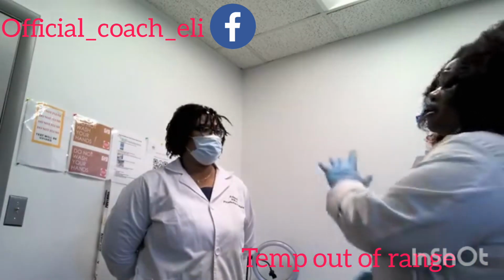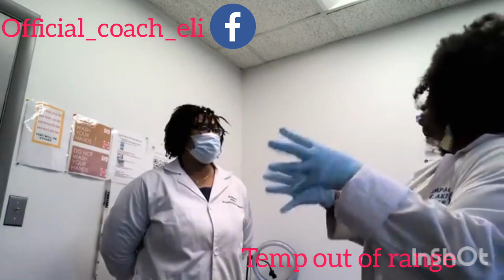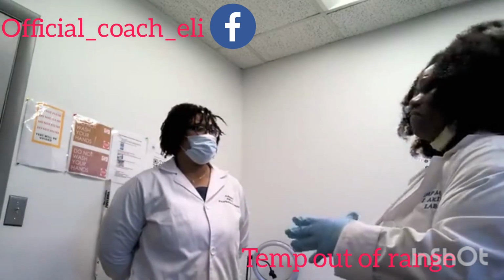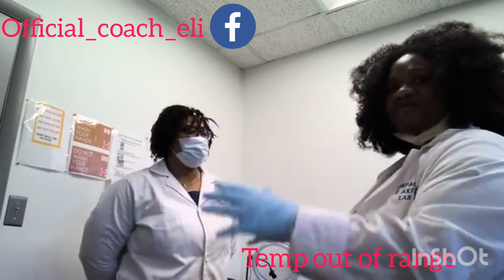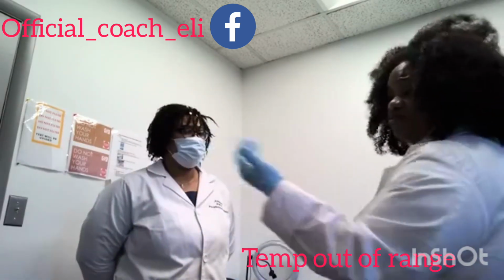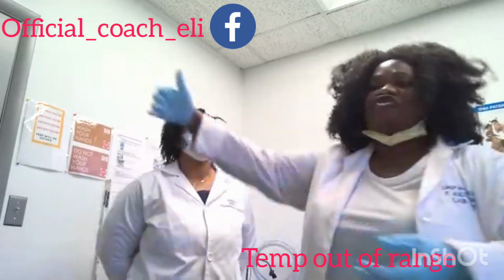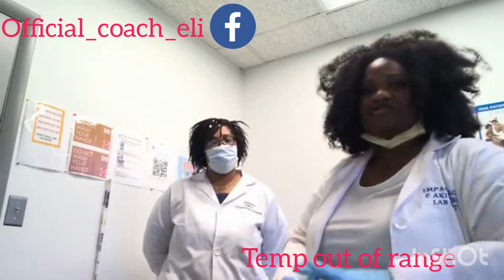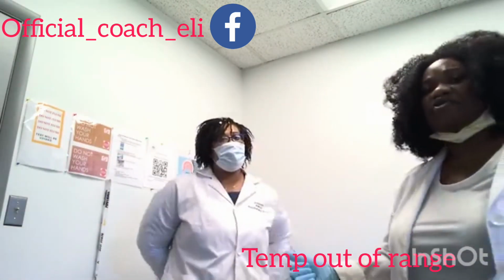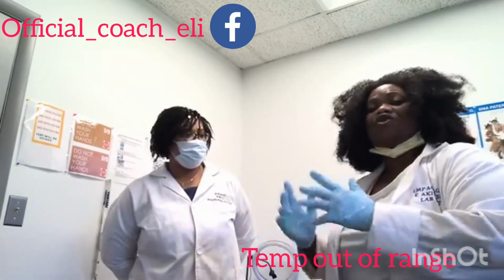Mr. Ashanti, Mr. Andrew is going to watch you. You both are going to go to the restroom, okay? And that's how you give both of them the same information at the same time. That's all. And once they bring back the specimen, you can let the other guy go and you continue with the process. So at this point, my donor is a female and I'm a female, so what I'll do is go with her to the bathroom together.